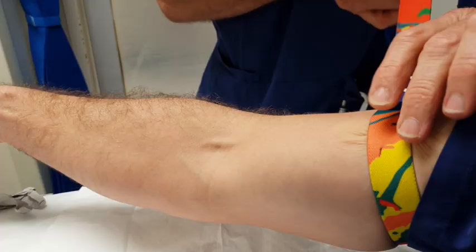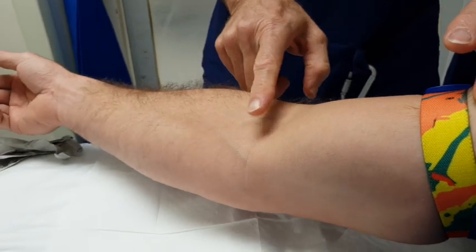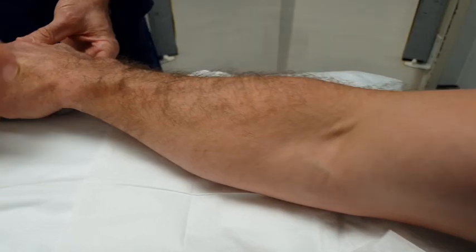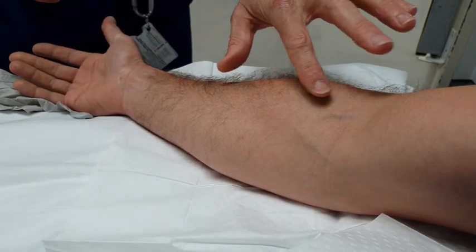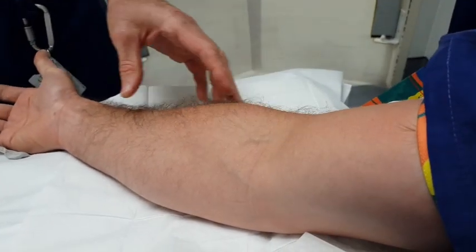The first thing I'm going to do when I come in and say hi is pop a little tourniquet on your upper arm, so it increases the tension through the vessels in your arm. You'll see that's a nice chunky vein that Pat's got here. There are other veins that appear in the back of the hand — you can see two nice big ones that have popped up on Pat. We're going to come up here, which is going to be a nice non-painful spot — great access and it's a big vein.